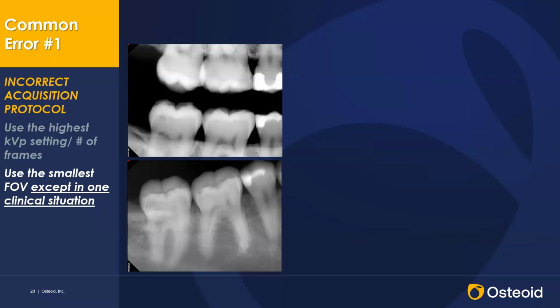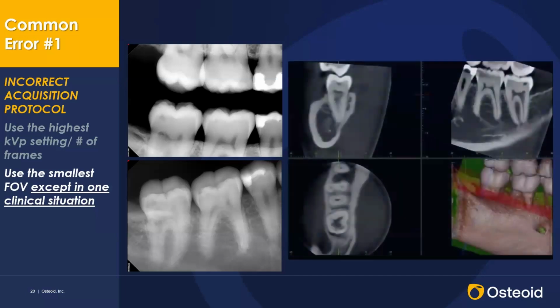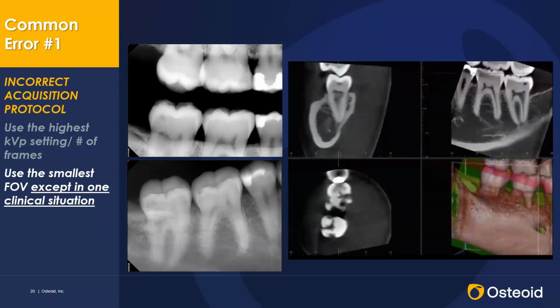And we can see there's a little circularity there. They took a periapical, and that's on the lower part of this image, and that tended to go away somewhat. But if we look at this and we took a cone beam, because there's another feature in the bite wing which you may or may not identify, and certainly when we see the cone beam in the retrospectroscope, as we call it, you can see it very clearly in the bite wing, not so much in the periapical. And here's the cone beam CT image.